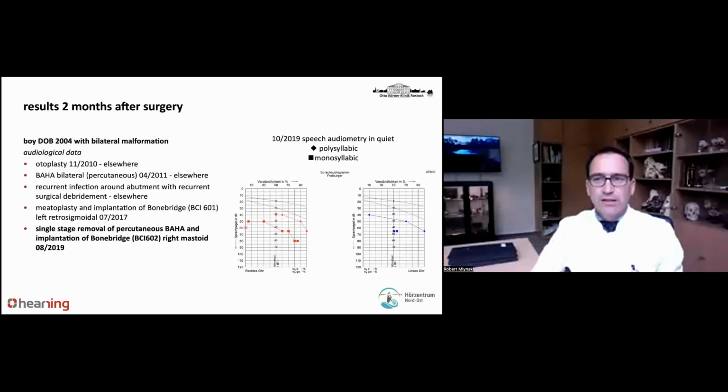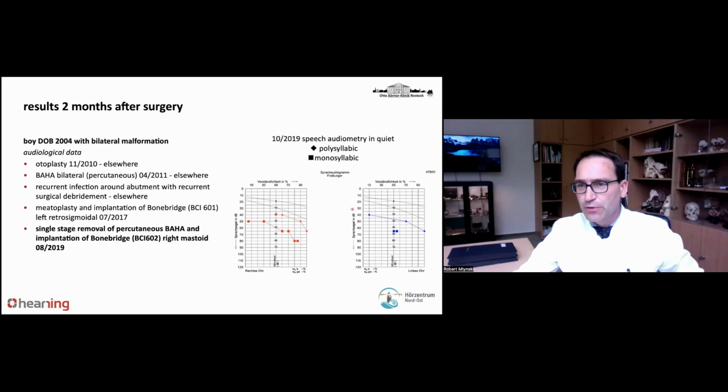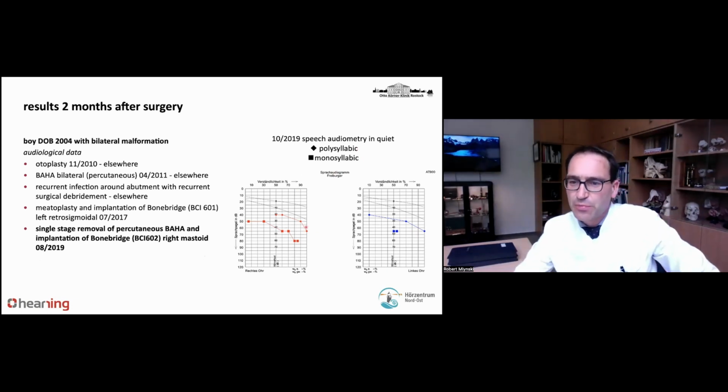Here we are. Here is the postoperative speech audiometry of the patient. As a German-speaking patient, we use monosyllabic and polysyllabic words. He has 100% speech perception at 65 dB in polysyllabic words, and 70% on the right side with monosyllables.